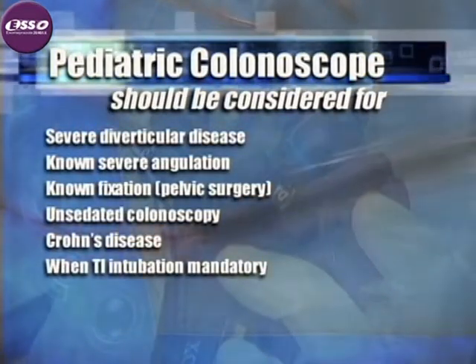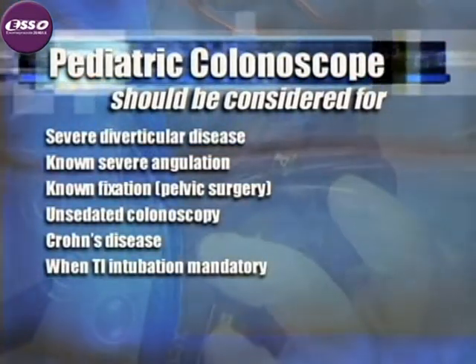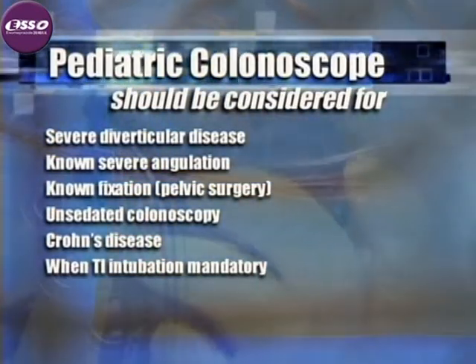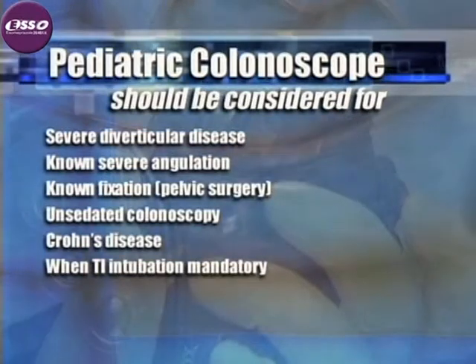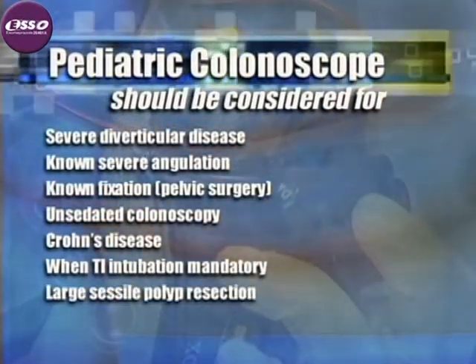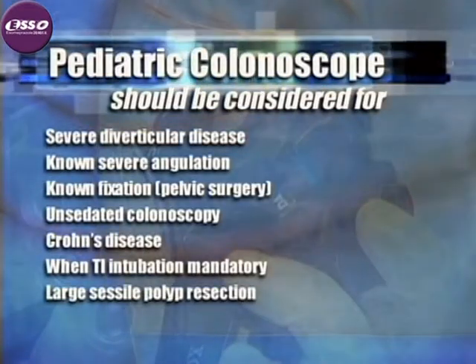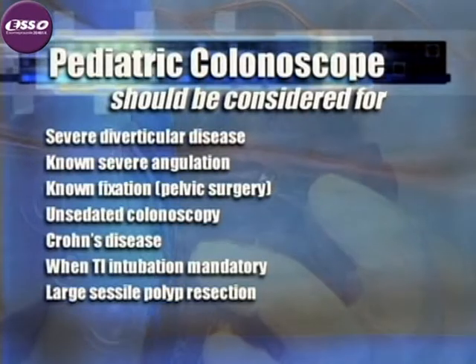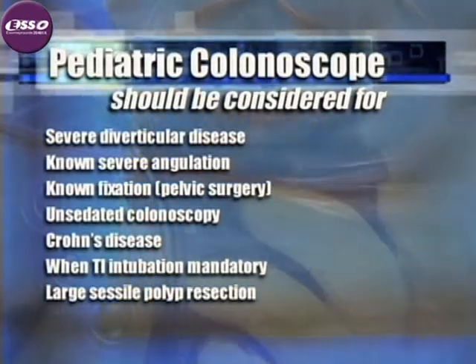For example, in the patient with unexplained abdominal pain and diarrhea, because it is just easier to enter the TI with the pediatric scope. I have a personal preference for the pediatric colonoscope for some cases of large sessile polyp resection because of increased maneuverability of the tip, including the ability to retroflex more easily in the cecum, the ascending colon, and the transverse colon.